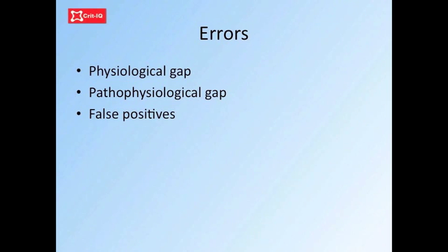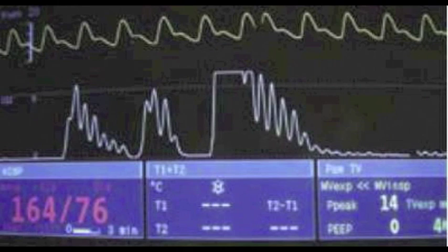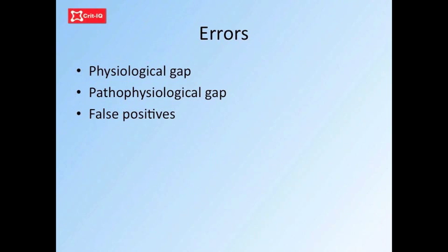False positive capnography in the intubation setting has been reported in association with prior consumption of fizzy drinks, though sustained waveforms and values do not occur. Occasionally, cardiac oscillations may be seen influencing the waveform. Infrared capnography is influenced by water vapour, and a moisture exchange filter should be placed between the capnography sensor and the patient where possible. Nitrous oxide also interferes with measurement, but this is rarely used in the critical care environment.